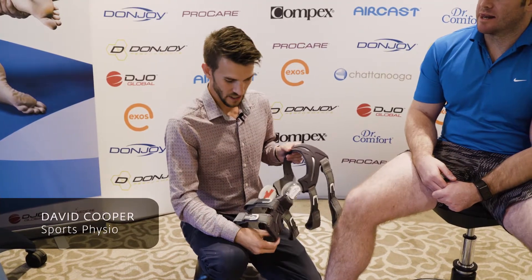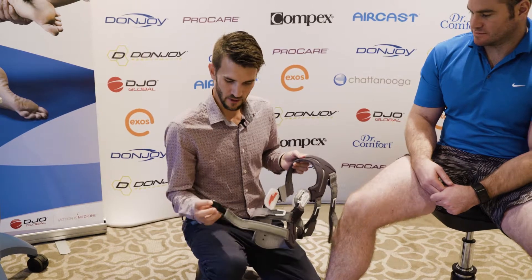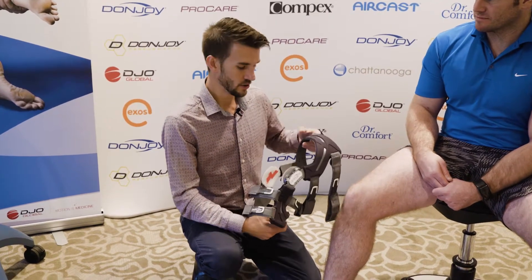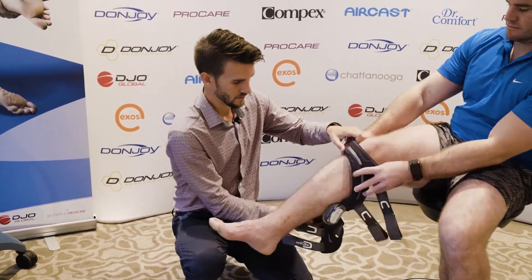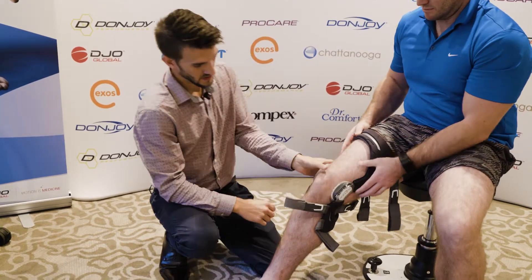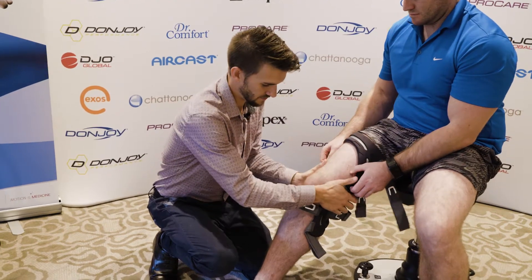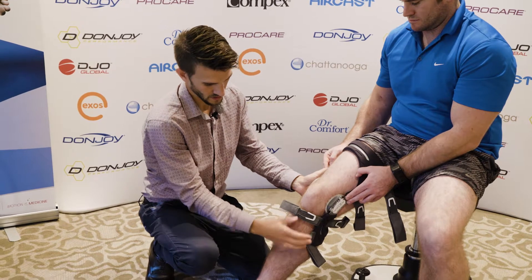The brace is designed to support the knee in a number of different ways, but it's important that it's put on properly. There are numbers on each of the tags that help provide a little direction as to where to go. Get the patient to put the knee brace on first, with the pads of those side bits sitting about a finger-width above the top of the kneecap, and far enough back on the knee so that it's sitting in the right place providing support.